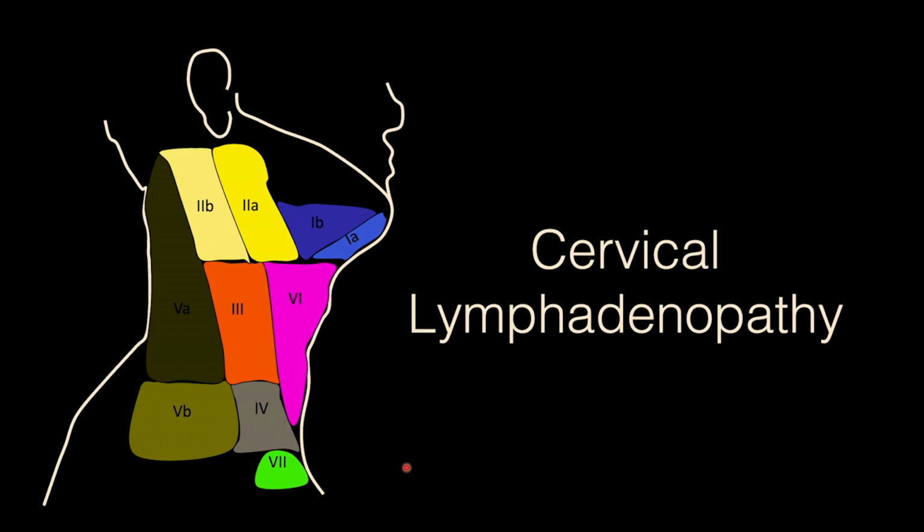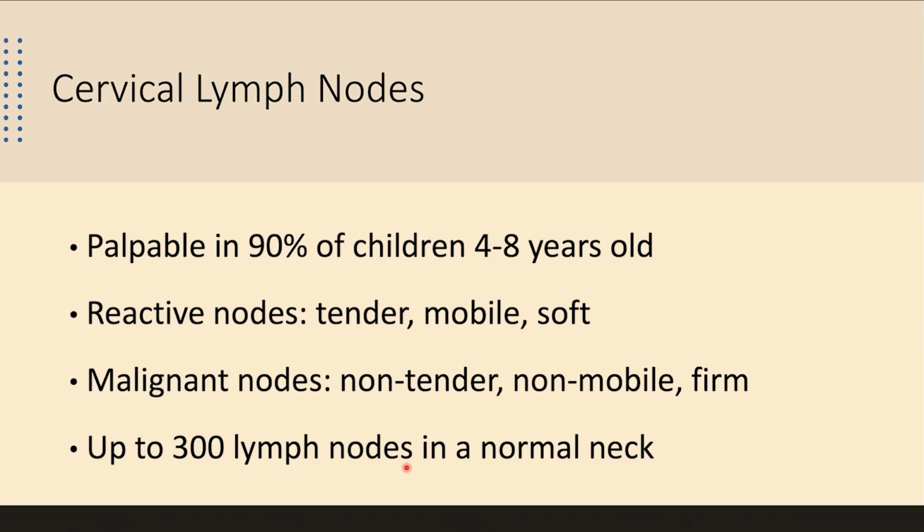So how comfortable are people with lymph node stations? It's very important to do this appropriately for your head and neck cancer people. Sometimes, based on your plane of imaging, it can get a little confusing. And I'll show you a phrase that I use when it's borderline between two stations.